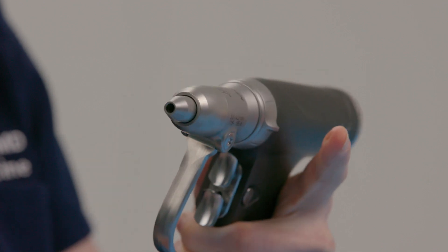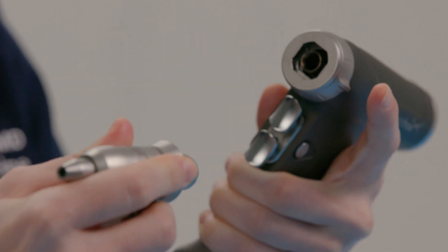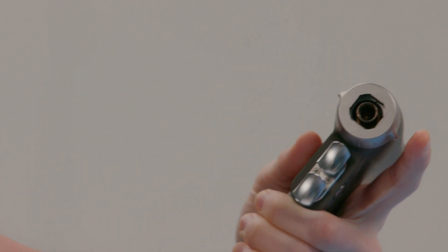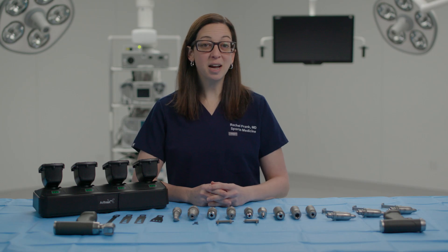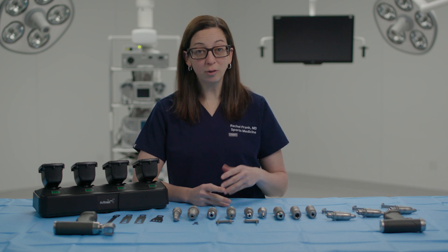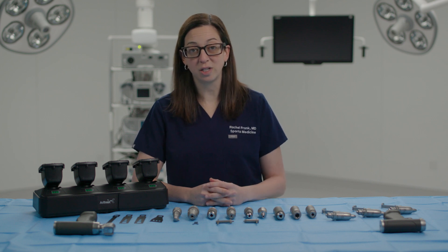My favorite feature of the drill is the twist collet mechanism. This design is intuitive and allows for attachments to be quickly changed during a case. This feature saves time in the OR, which increases OR efficiency and creates a smoother experience not only for me as the surgeon, but also for the staff.